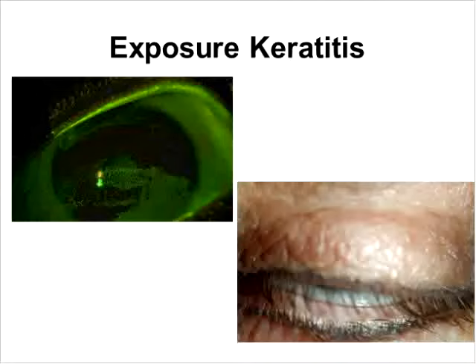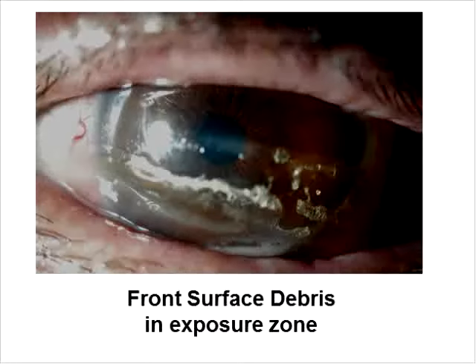And in addition, you can see an example of a post-blepharoplasty patient, and this is right here, and you can see she can't close her eyes, and this area is definitely going to desiccate with lens wear. And here's an example of that exposure zone-related front surface debris.